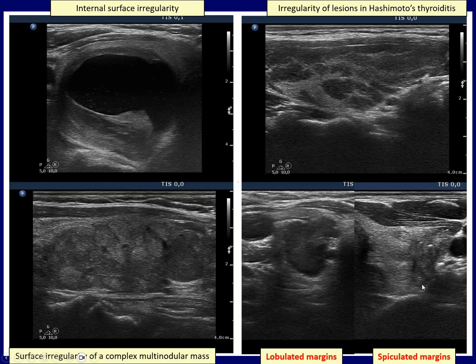Finally, two examples of pathological lobulation and spiculation. The former is characterized by curved angles — here is a lobulation. The latter by sharp angles — this is a spiculation.